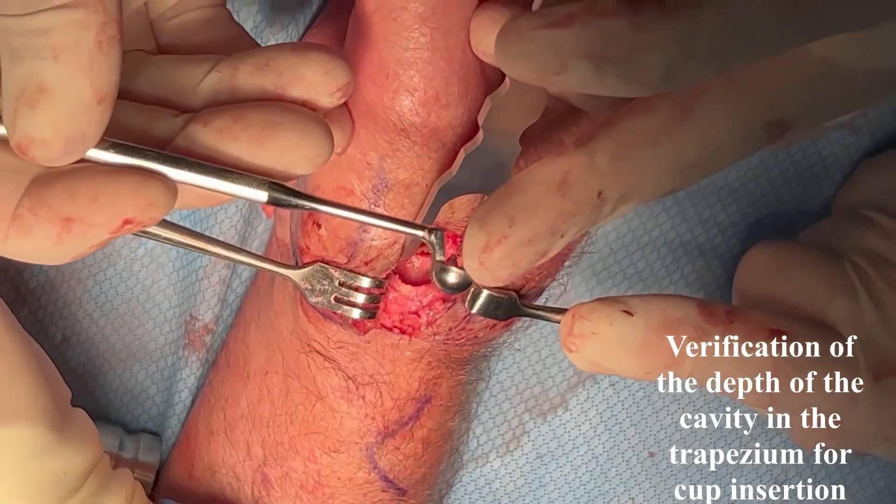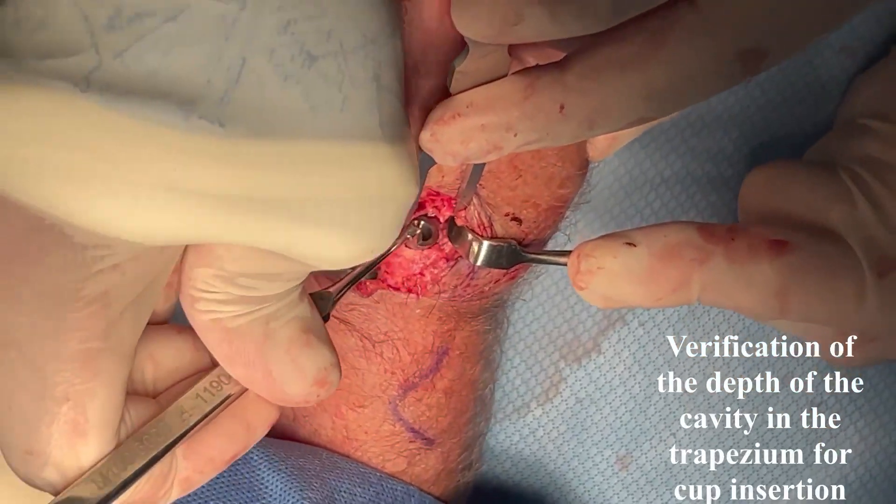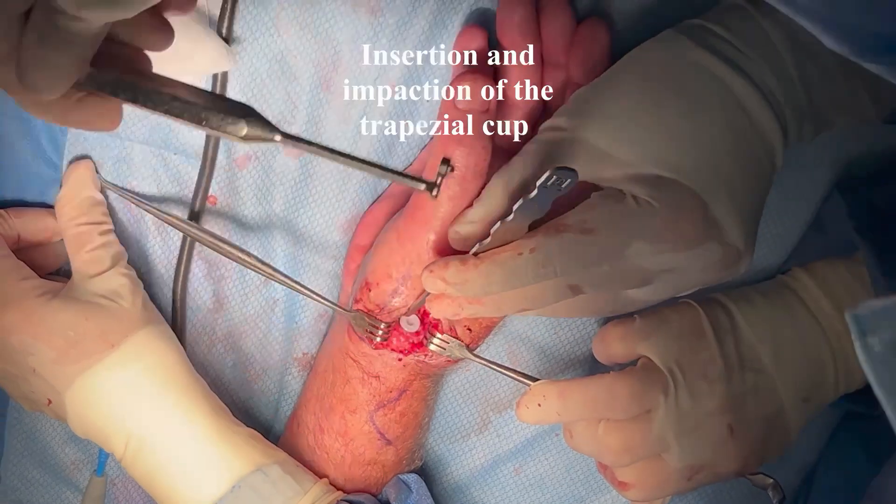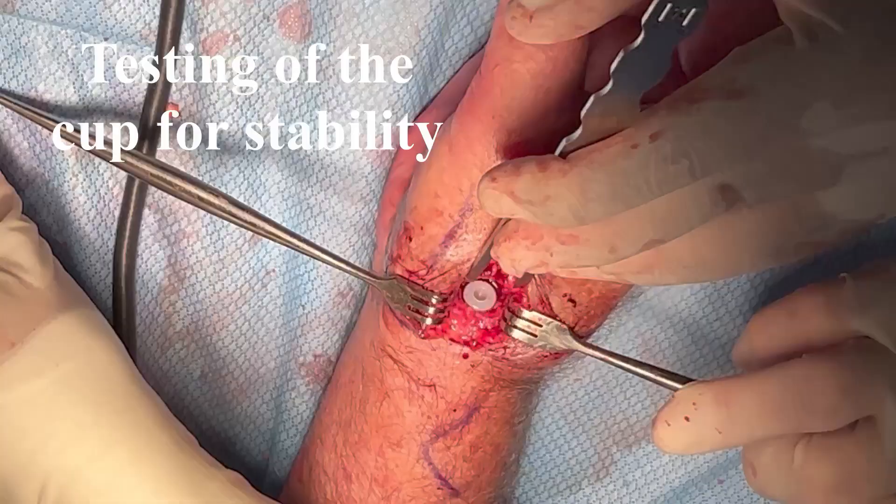The size of the trial stem is selected. The next step is the preparation of the trapezium. The depth gauge allows to choose the proper cup for implantation.